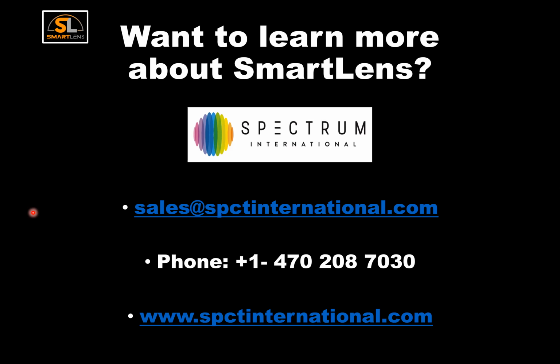And it's a very simple answer. We know from the scleral studies, we know from the corneal studies as well, that the corneal sagittal depth can range by at least 800 microns. In some cases, it can be as broad as 1800 microns. So we need an incredible range of sagittal depths for just the cornea.